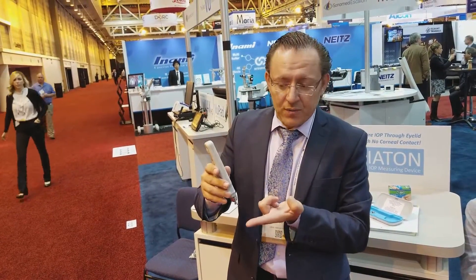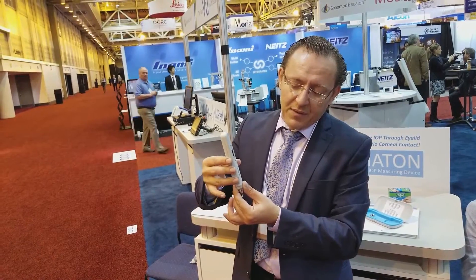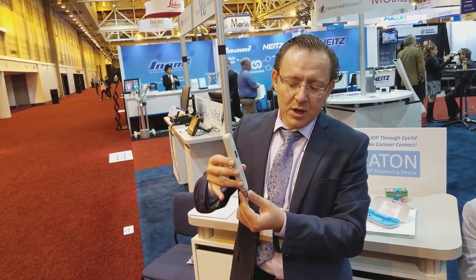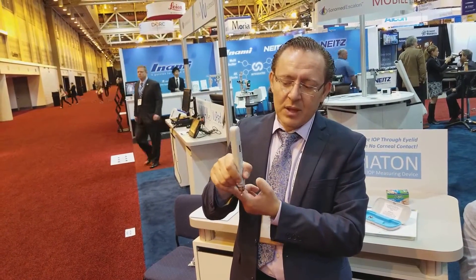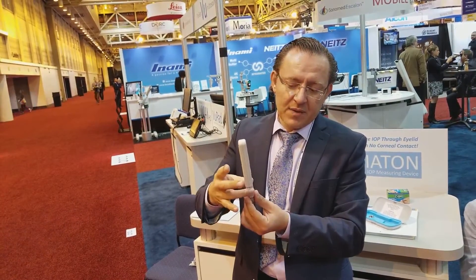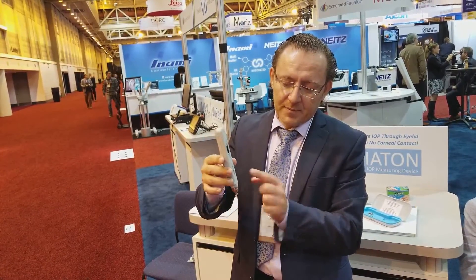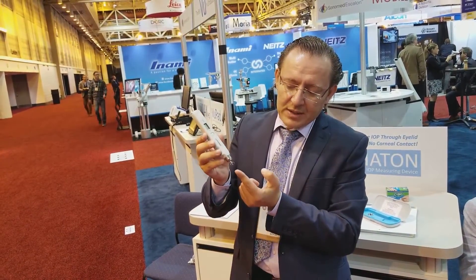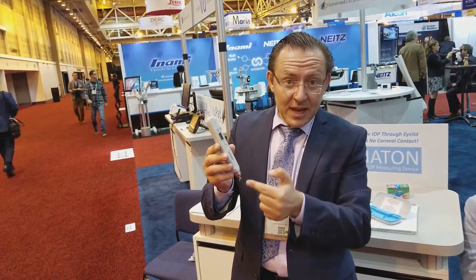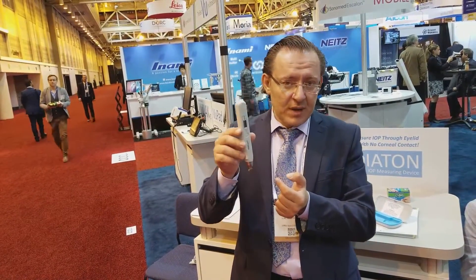I also strongly suggest taking a few readings on your own finger. A couple of things about how to hold the device: three fingers on one side, thumb on the other. Do not hold it like a pen — it will limit your positioning. The device has a little floater which moves up and down. To get the floater in, simply tilt the device back and it goes in and fixates.